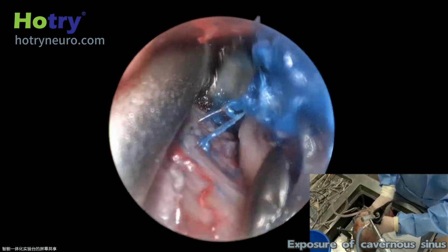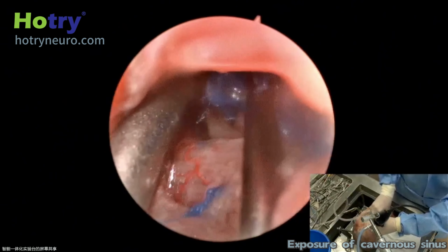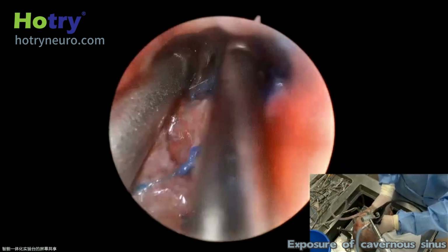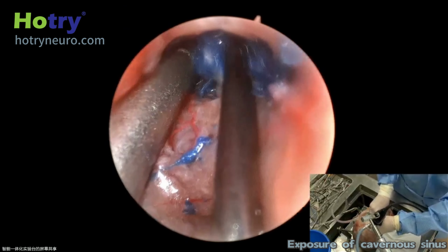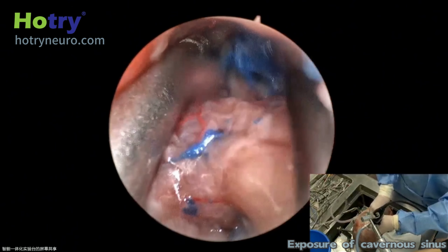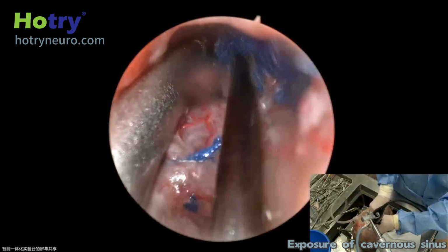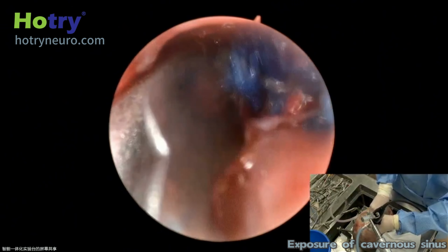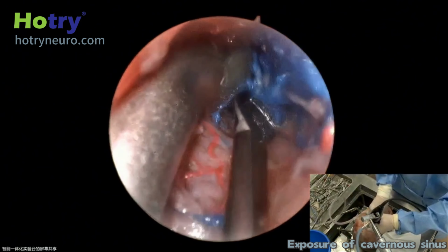So this is the carotid in the medial. This is the sixth. This is V1. Here is the carotid, medial to this blue cast.